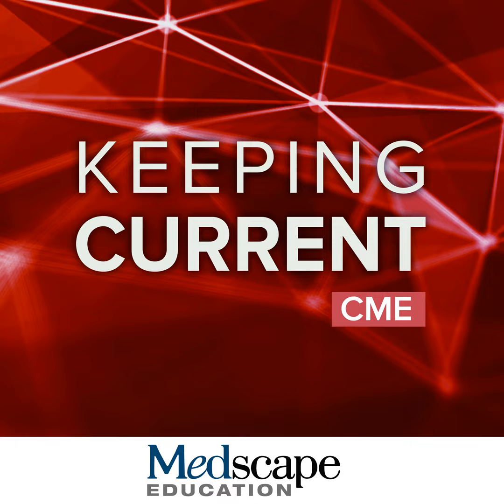Okay, now, what about amyloid and tau PET? So this comes out of the work of the Alzheimer's Association and Society for Nuclear Medicine. So if somebody has a high degree of suspicion for Alzheimer's disease, whether it is mild cognitive impairment or dementia, an amyloid PET is almost always appropriate. So this grading scale goes from 1 to 9, with 7, 8, and 9 being in that somewhat to highly confident that this would be helpful.